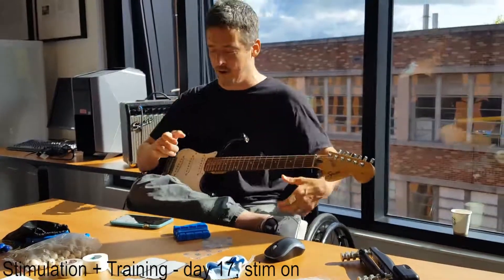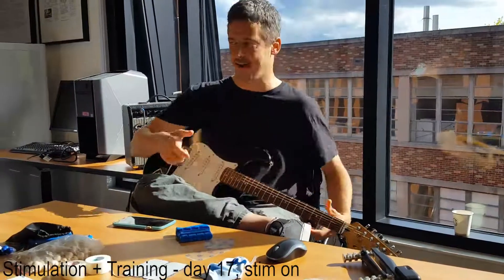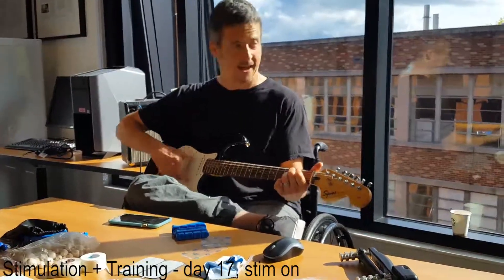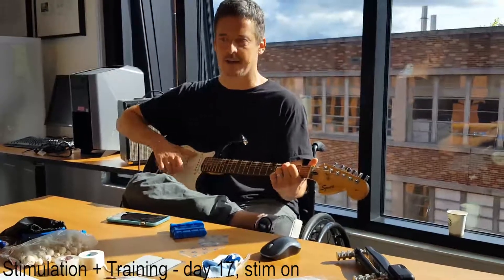I focused and worked at it for an hour. It's like we can strum it and get that movement going, but we just can't do it right now. So I'll just sit there for like a half hour and pull it and get down. That's why that particular movement is not so much better — just do it over and over and over until it starts to get a little better.